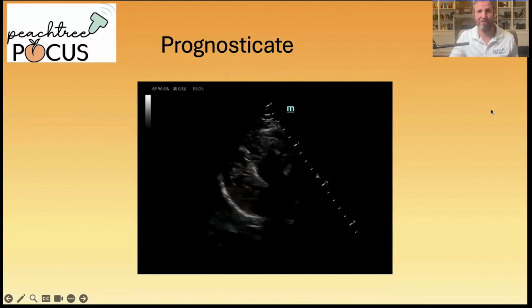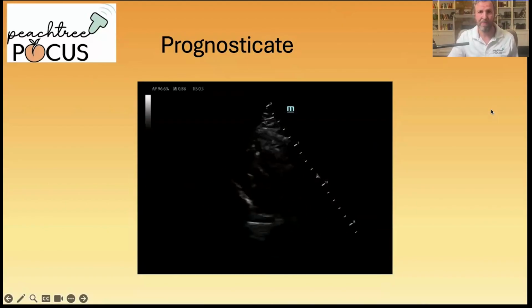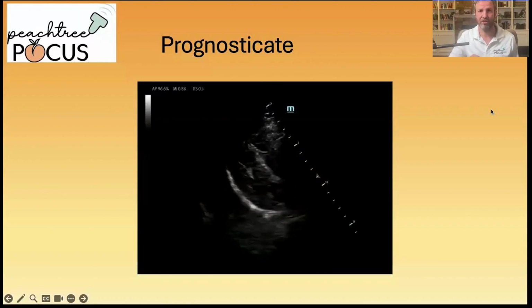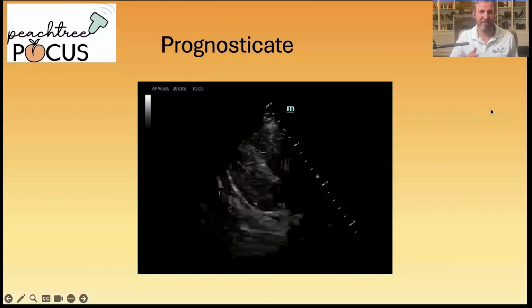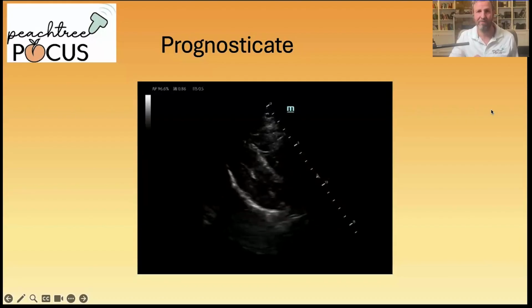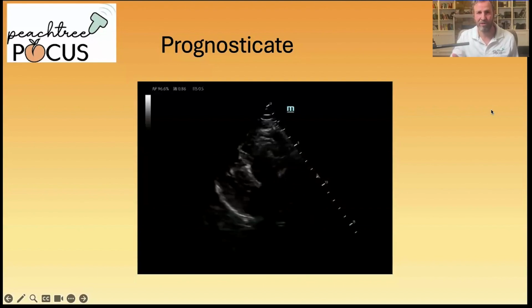This is an extremely rare finding, and this case is the only time I've personally seen it, and I work at a very high volume trauma center. But in this case, it underscored what we already knew. In a trauma arrest with a prolonged downtime, resuscitation would be futile. The absence of cardiac activity alone in someone with a prolonged downtime in trauma, even if it's penetrating trauma versus blunt, is already a very poor prognostic sign. Add to that the empty left ventricle, and the decision was made not to initiate resuscitation.